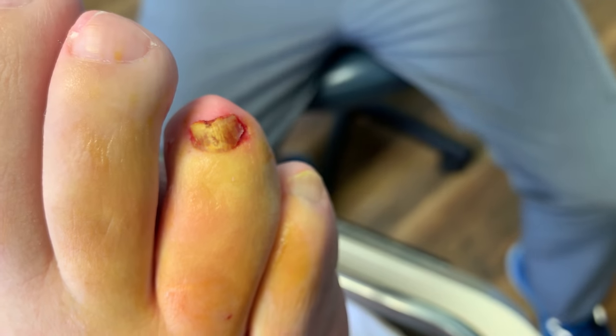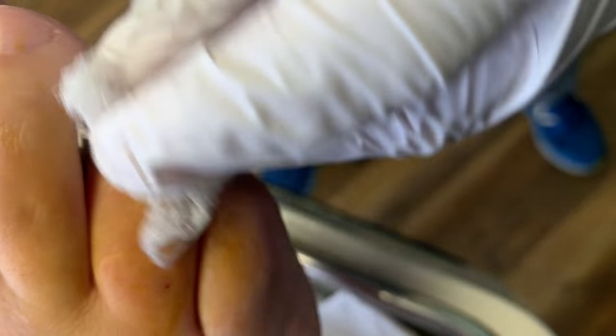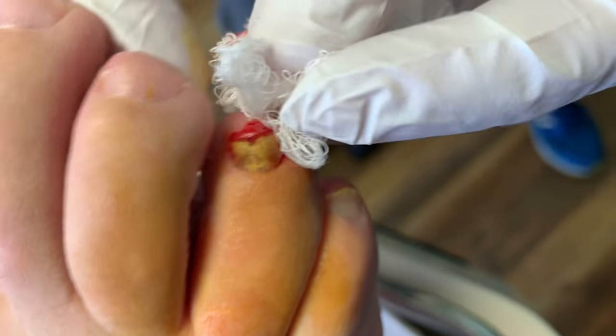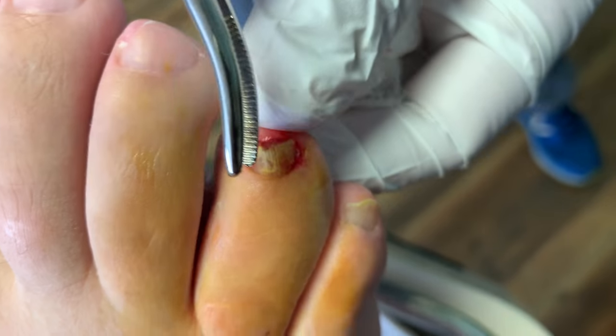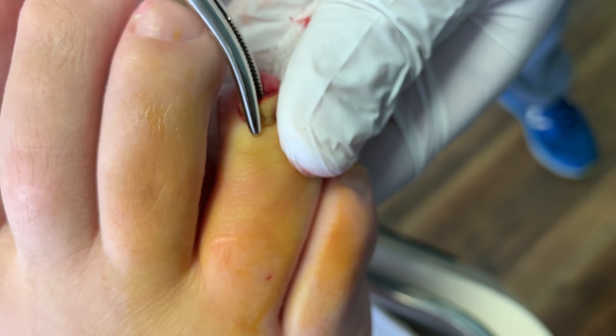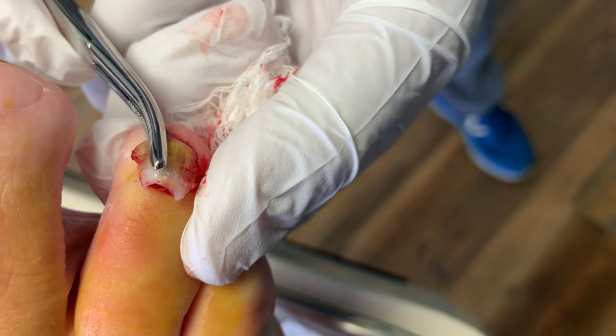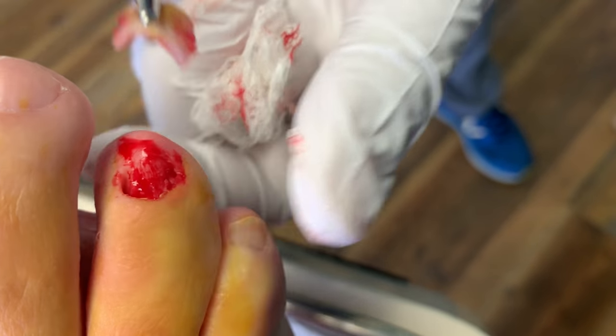And then we get our trusty hemostat. I usually stand for this part of the procedure to get more leverage. Get way underneath the nail, and then you just pry it away nice and easy.